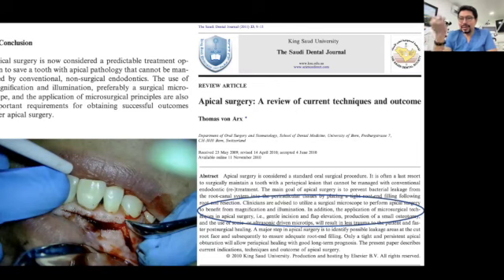Most of the advantages of having this technology are related to the comfort of the clinician. Now it's much easier to be a dentist. But the clinical microscope, the operative microscope in general, is a tool, a device that really helps us to increase the success rate of our treatments, and it is evident when we think about microsurgery.